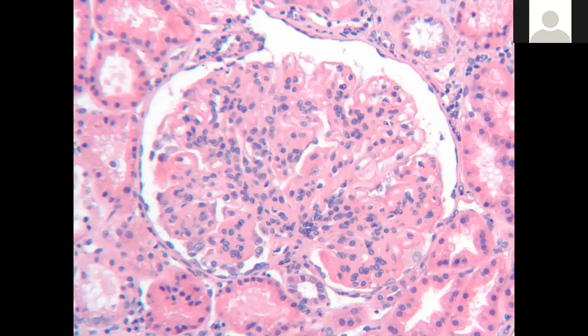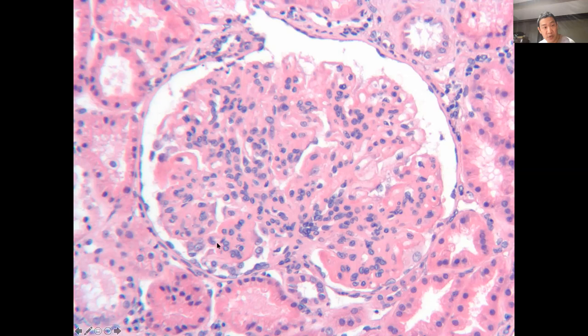There is definite mesangial expansion with more cellularity in the mesangium, and also endocapillary proliferation. The capillary loops in some areas look closed with stuff in them. There's mesangial hypercellularity — you can see 10 to 15 cells in the space. So we have mesangial hypercellularity and endocapillary proliferation.